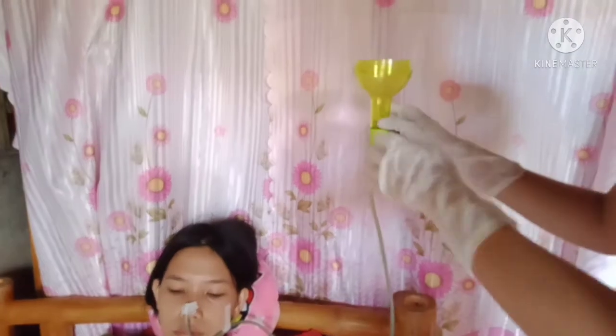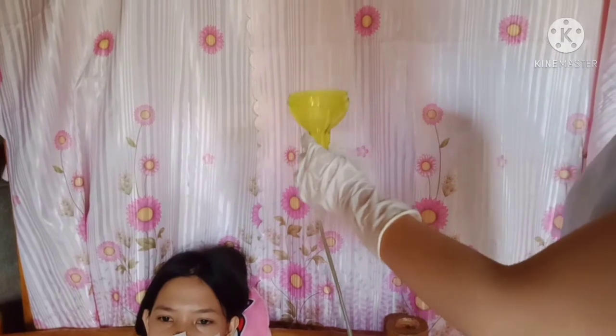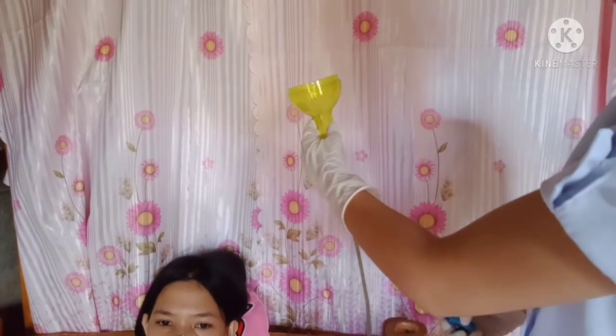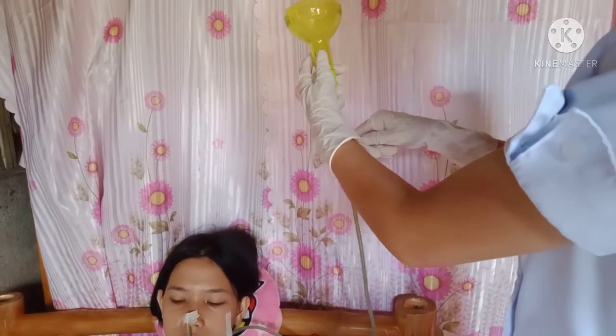So when tube feedings are not administered, cap or clamp the proximal end of the feeding tube to prevent air from entering the stomach between feedings. So for example, this is our clamp. Proximal end.